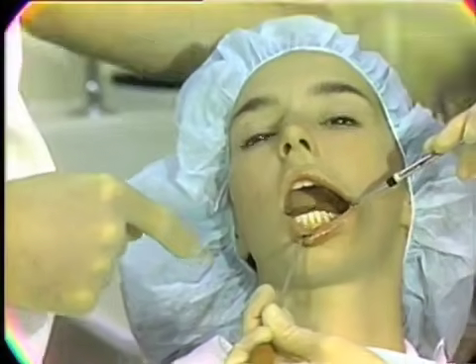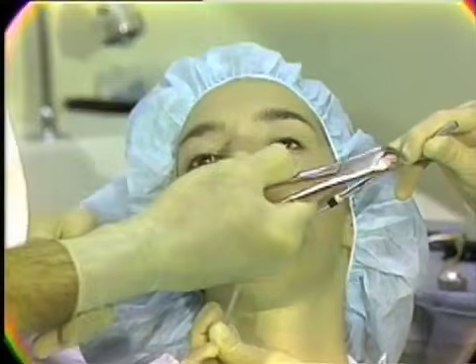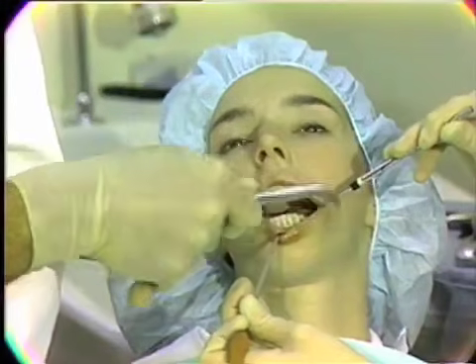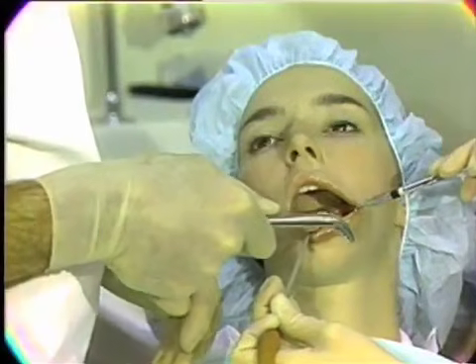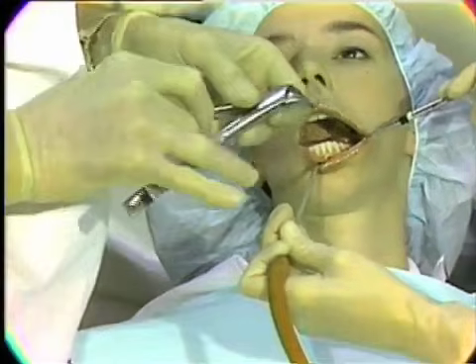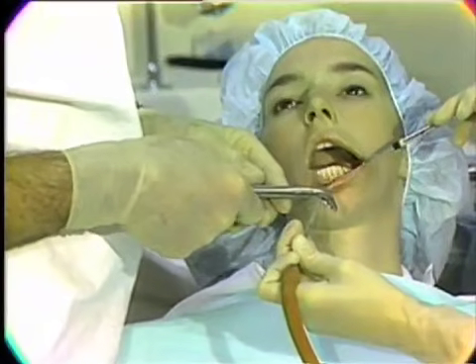The forceps are grasped well down on the handles, and they are grasped in this manner so that you do not have anything that is awkward in the neuromuscular relationship of manipulation of the tooth. If you engage the handles in a backward or some awkward position of this nature, you will not have sufficient control over the manipulation of the tooth.